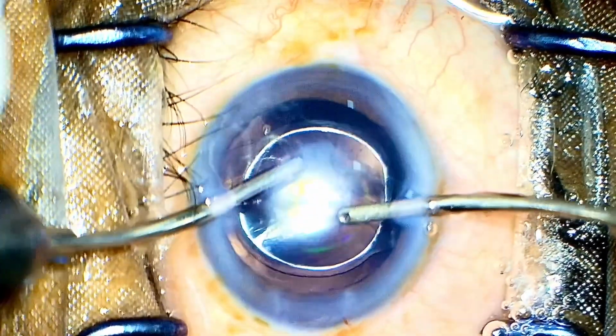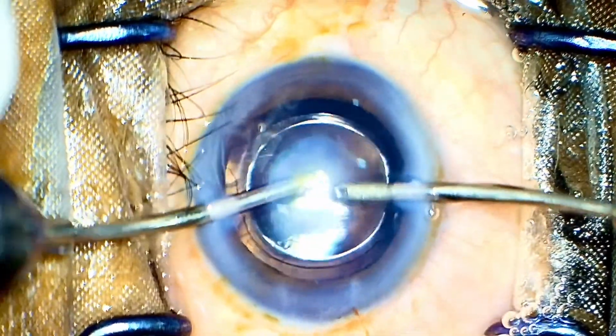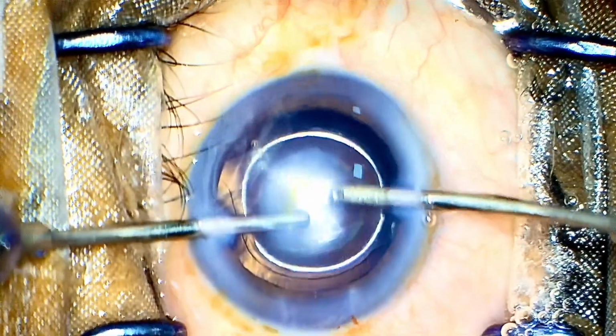But yes, I'm just taking out the visco. I'm just going to conclude the case now.